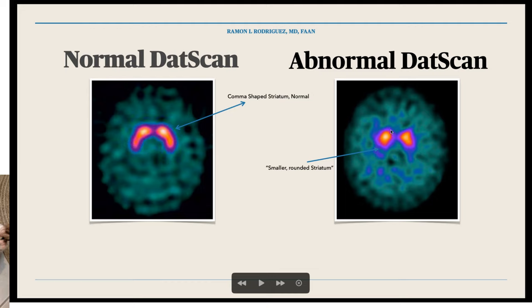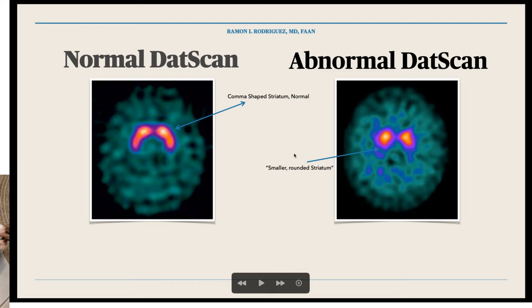As we move to the image on the right side, we see that there is a decrease in the uptake of this contrast — we don't see that comma shape. So this is abnormal, and many times we also see an asymmetry where one side is actually smaller than the other side, which goes along with the typical finding in people with Parkinson's where one side of the body is typically more affected than the other.